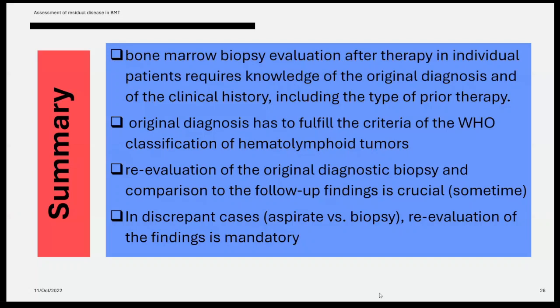Number 2 is which type of CD68 is the best to stain monolineage, either KP1 or PGM1? Okay. Both are equally sensitive for the monocytic lineages, but PGM1 is claimed to be more sensitive for detecting the immature component.